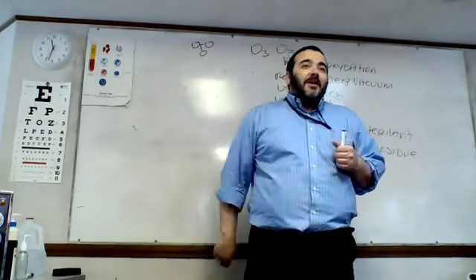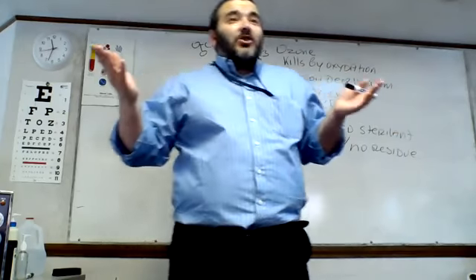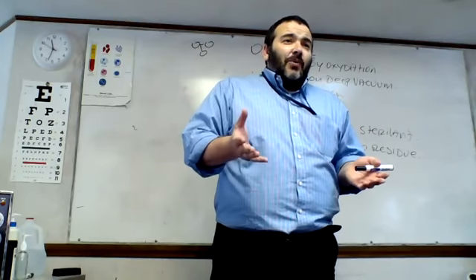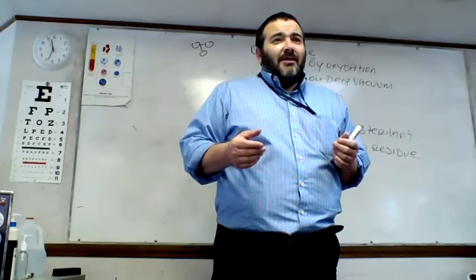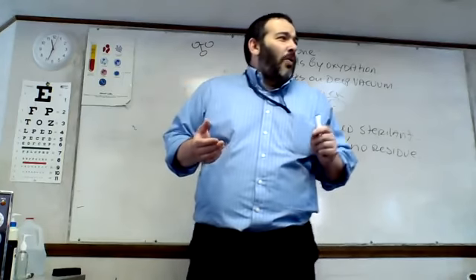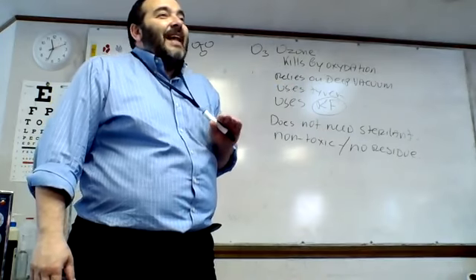Can you explain "do not need sterilant"? Yeah, we make it out of thin air. I don't need to buy anything because remember, it's oxygen. All I got to do is separate out oxygen from the other gases in the atmosphere, take the oxygen, zap it with a radio frequency, clump together that third oxygen, that extra person on the date, and you have your O3. That's it, but only for a short while we're playing games and sterilizing. After that, it falls apart. Make sense?